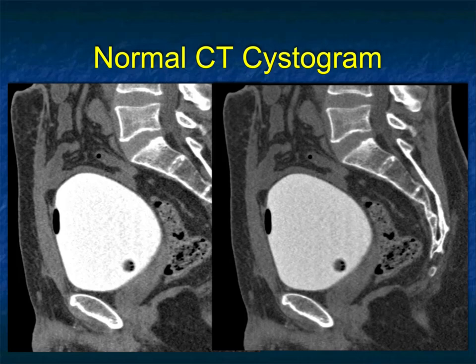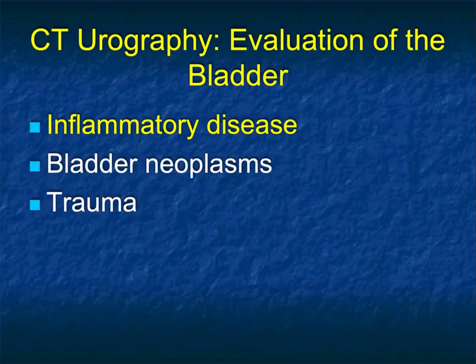And here's two more sagittal views. The bladder is very smooth. There's no leak from the bladder. There's no evidence of pathology in this case.